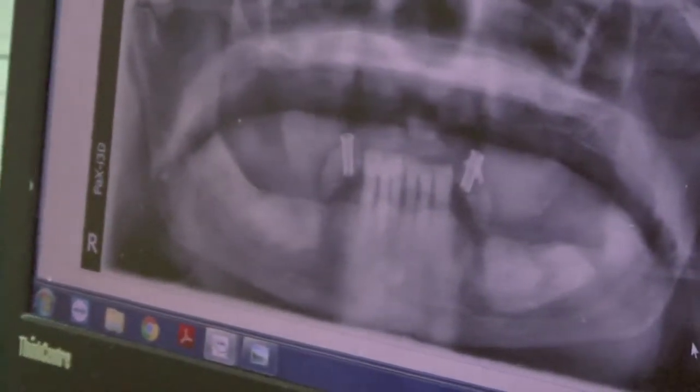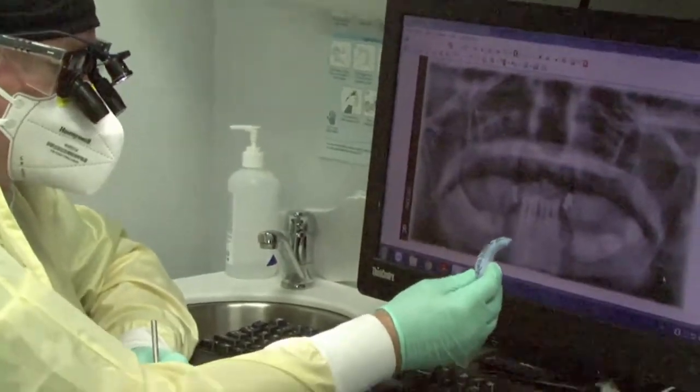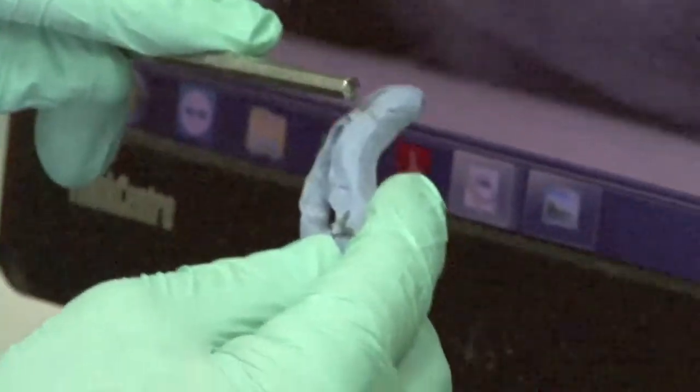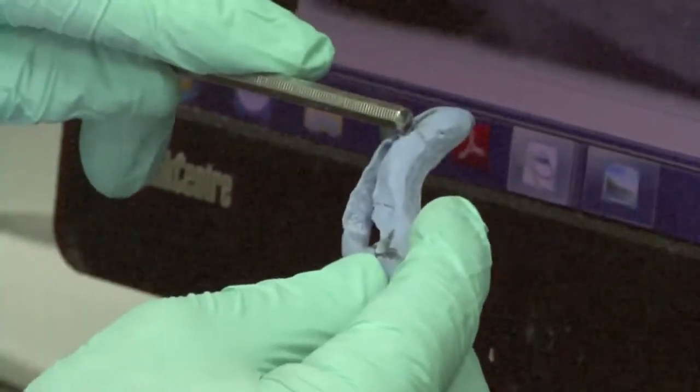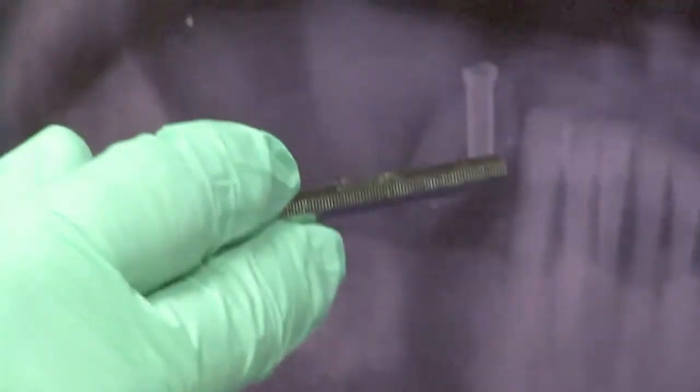And we're going to use the same guide that we used. We've taken out the metal in the middle, and all we want to do is to drill a hole through the skin and into the bone and make a marker in the bone. Once we've gone ahead and made a marker in the bone, then we'll go ahead and we'll correct our long axis of the drill so that the drill is going parallel with the canine on both sides.